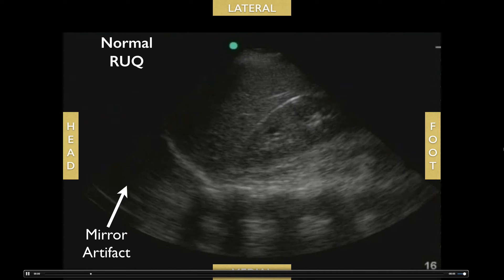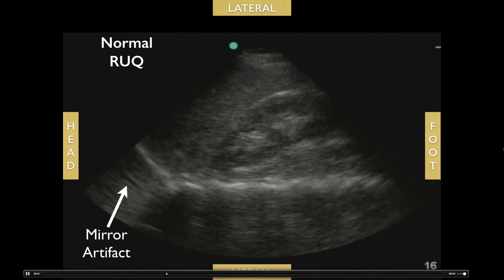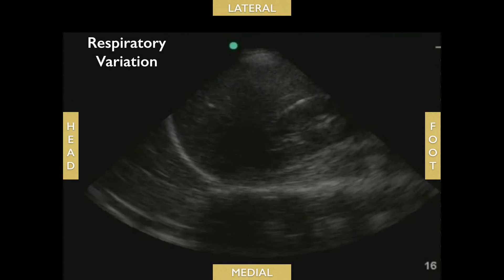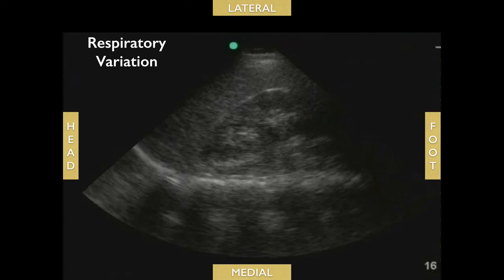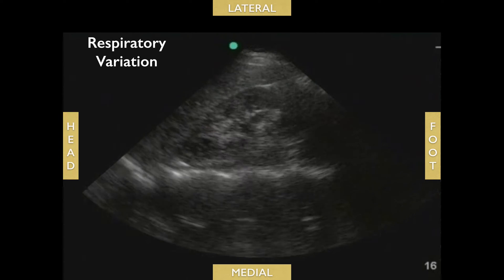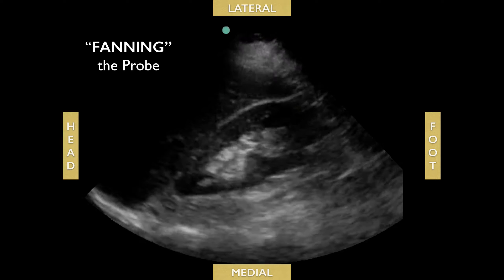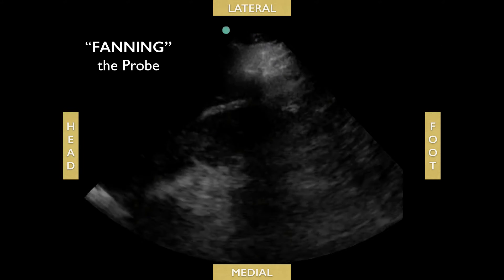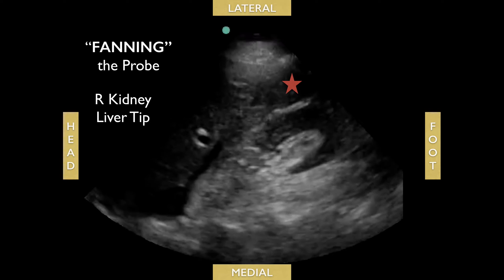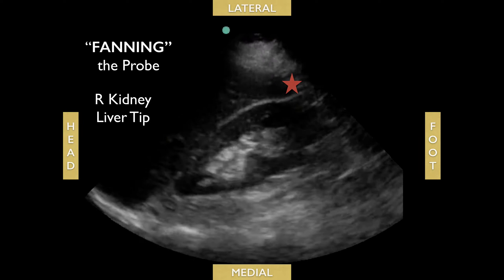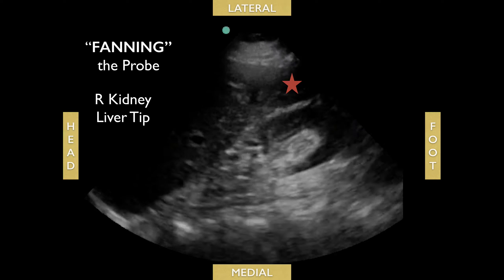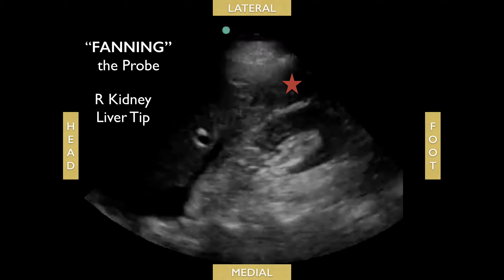If you do see the spine continuing past the diaphragm, you might have fluid in the chest. Remember that when the patient breathes in and out, that affects the views. Fan the probe to make sure you're not missing any pockets of fluid, and also check the right inferior portion of the kidney as well as the liver tip.